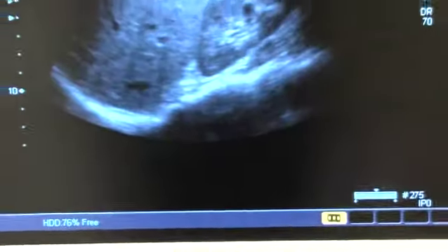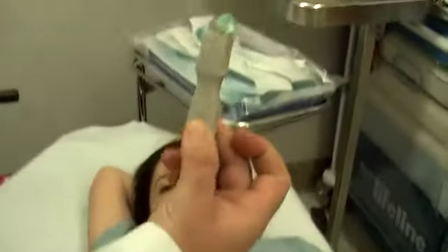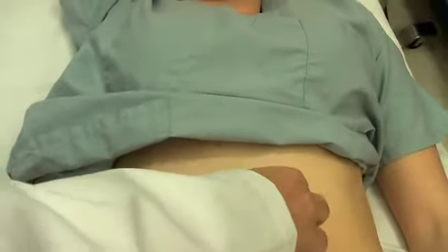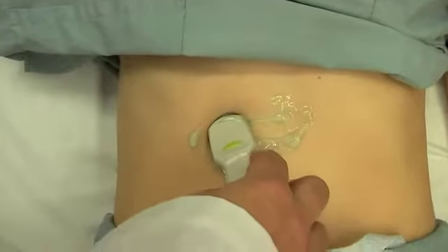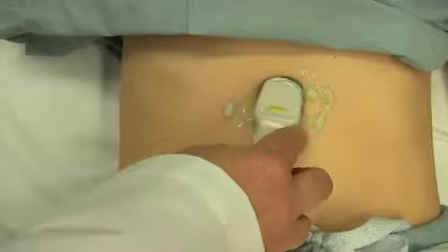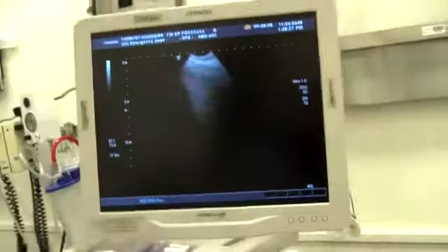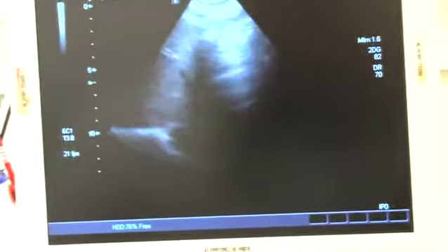Okay, so the next view for a FAST scan, we're going to hit unfreeze and we're going to go back to scanning the patient. So we're going to move to the subxiphoid view of the heart. Again, be cognizant of where your indicator is. It needs to be the patient's right for this. Sorry, it's a little cold here. It's going to be right in the subcostal space, somewhere between the right subcostal margin, using the liver as an acoustic window, or the subxiphoid space. Somewhere in this range you're going to find it. So I like to start near the liver and go through the liver. Sorry, it tickled a little bit. Go through the liver, because it doesn't attenuate sound very well, so sound can go right through to the heart, and you can kind of sweep over. Take a deep breath. It helps to take a deep breath to get that subcostal view in.